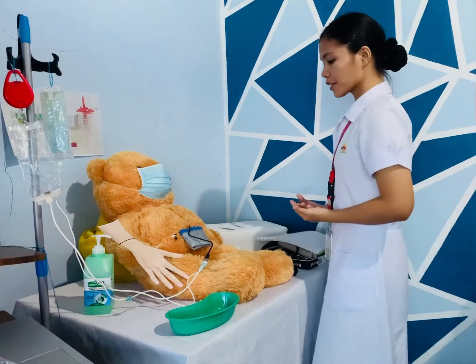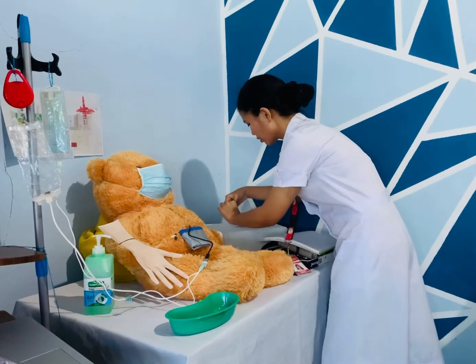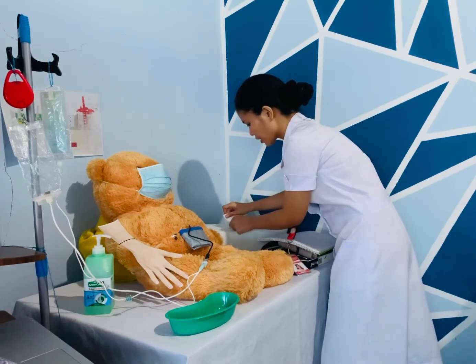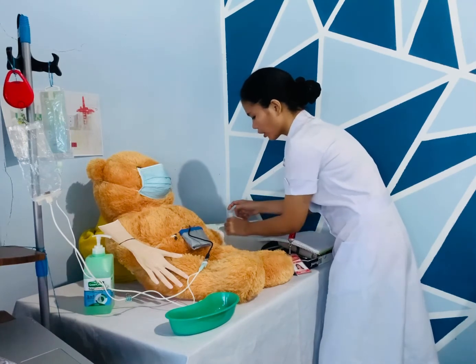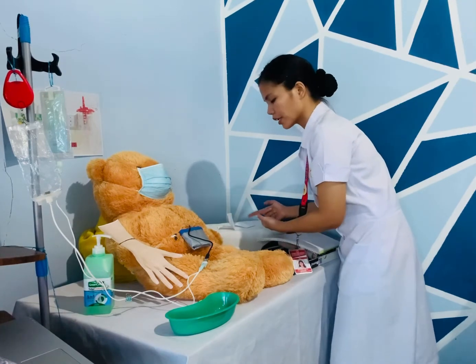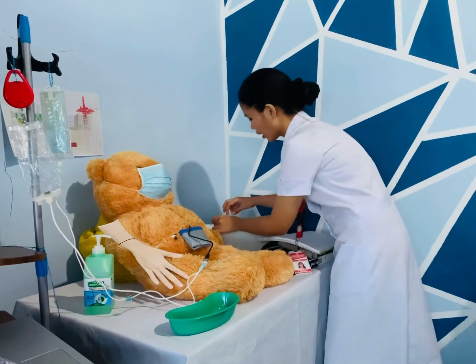Okay, so next, open the mini cup package. Then check for the presence of iodine sponge. Okay, so the other mini cup will only be used if the first mini cup is contaminated in any way. So, ayan.